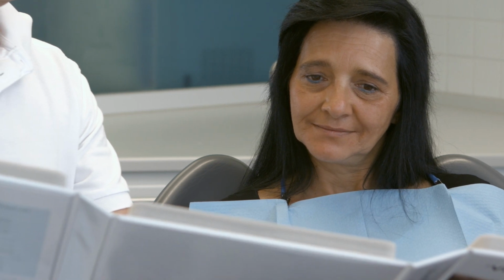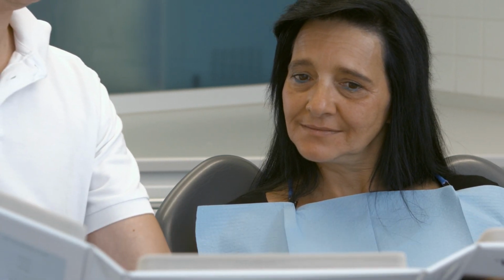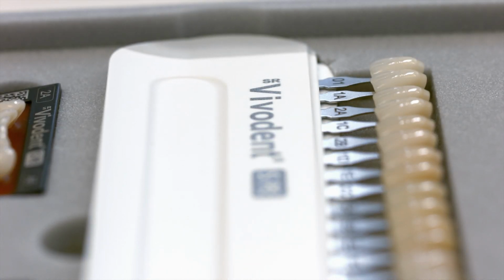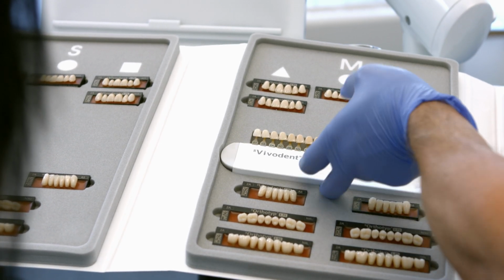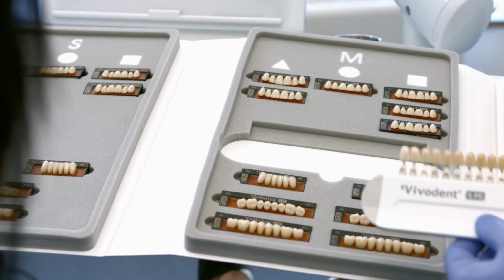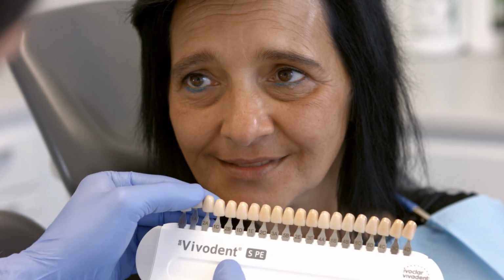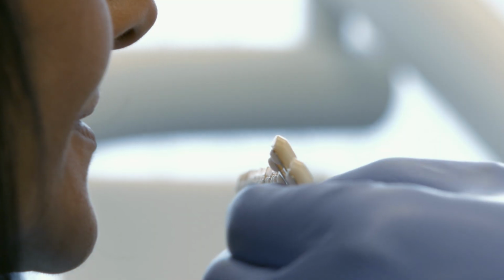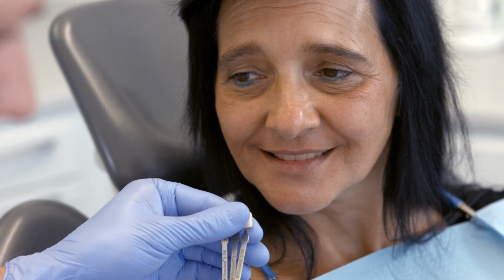your patient. Discuss distinctive anatomical features and personal preferences with your patient. Select the tooth shade on your patient under defined light conditions at a color temperature of 5,500 degrees Kelvin or under daylight. The sample teeth of the SR VivoDent SPE Shade Guide feature the same layering structure and material as the original SR VivoDent SPE molds. This results in fewer and less severe shade deviations.